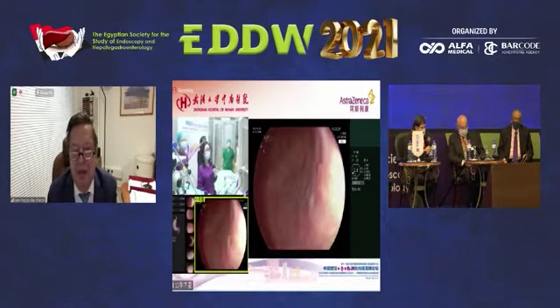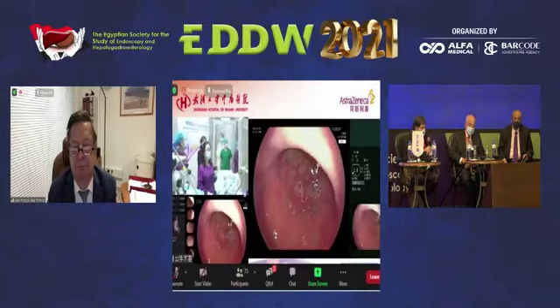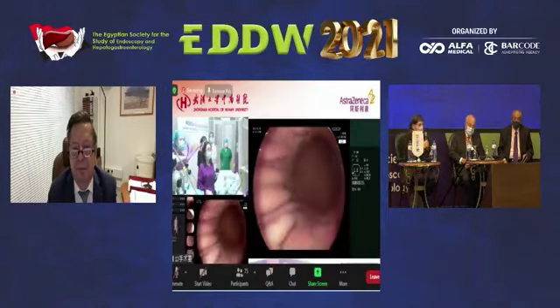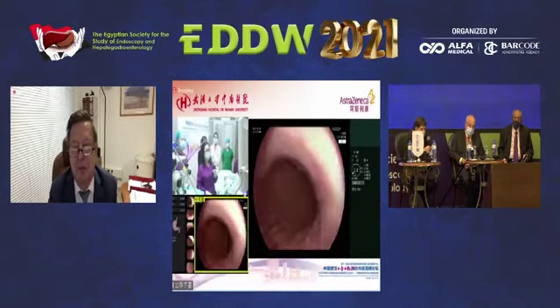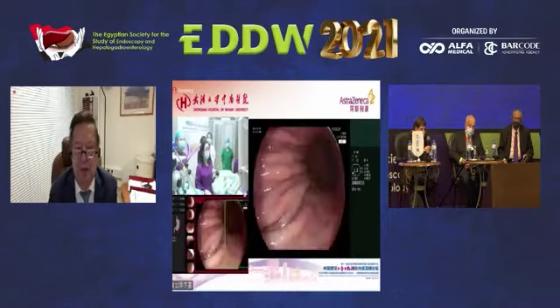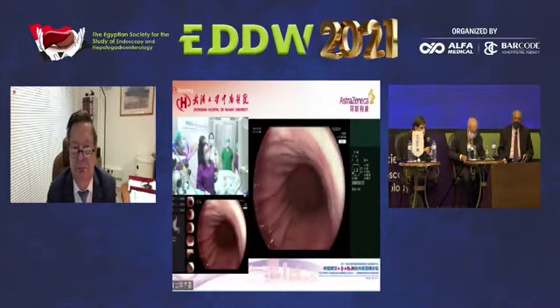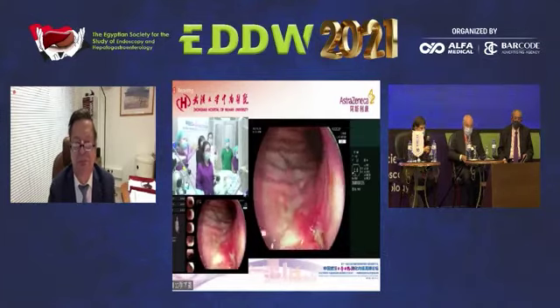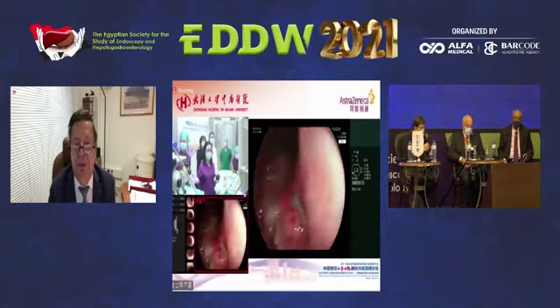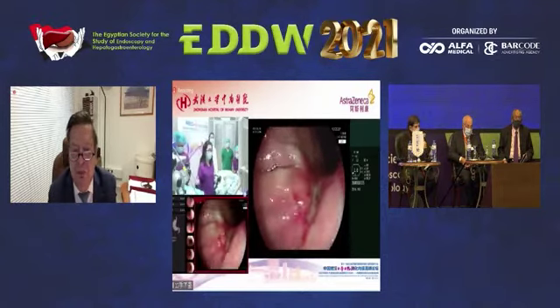This is LCI, and LCI is important to enhance abnormality. And you see, in that case, you have intestinal metaplasia enhanced by the LCI. The LCI is equivalent to TXI from Olympus, just released last year. It's well demonstrated, and that's a live demo.